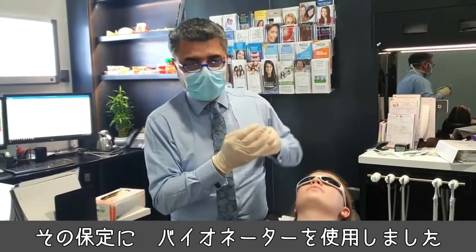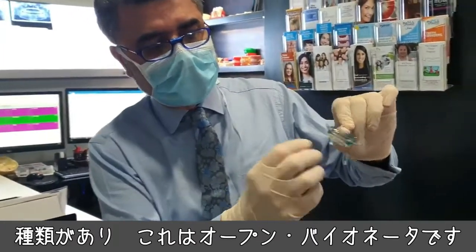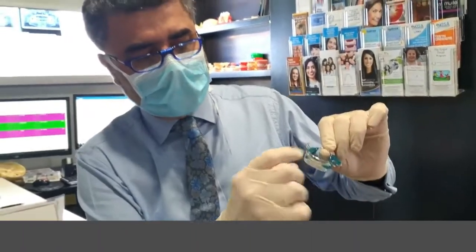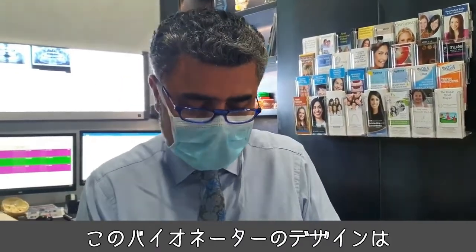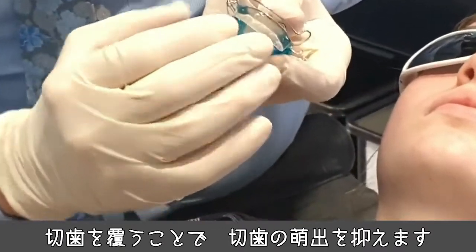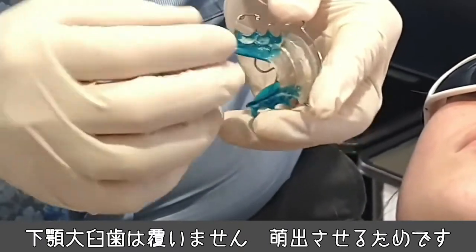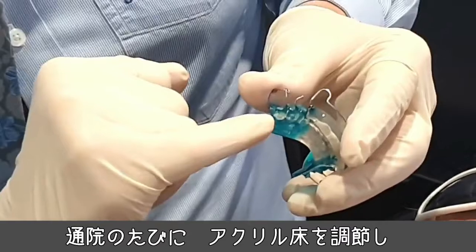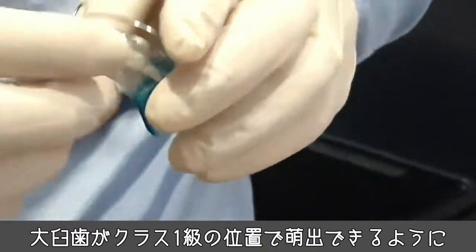To maintain that, we use what's called a bionator. There are different types of bionators. This is called a bionator to open — meaning to continue to open the deep bite. The design has incisal capping to prevent the incisors from erupting, but on the back we don't have anything covering the lower molars because I encourage them to erupt. Every visit we adjust the acrylic so those molars continue to erupt in a class one position.